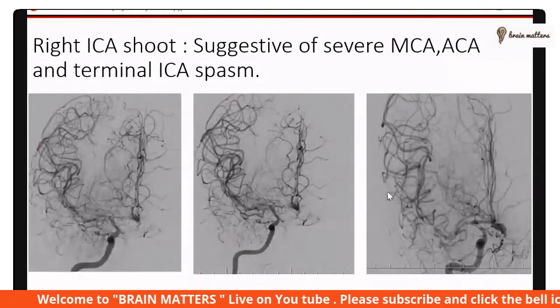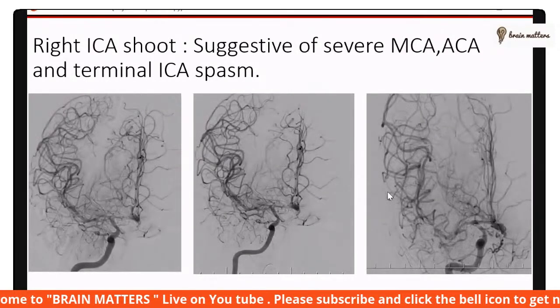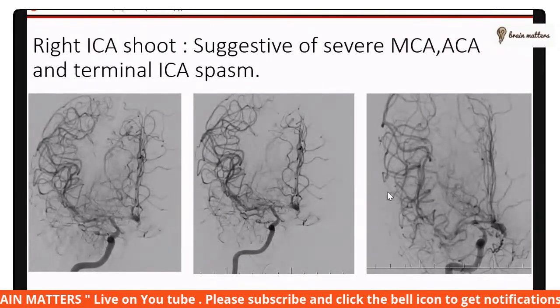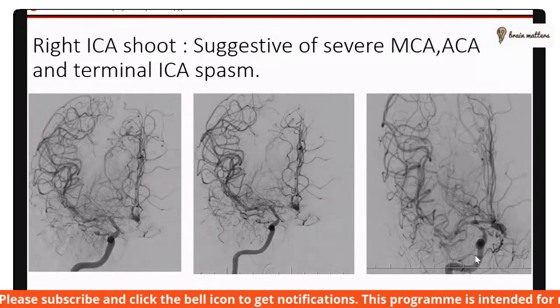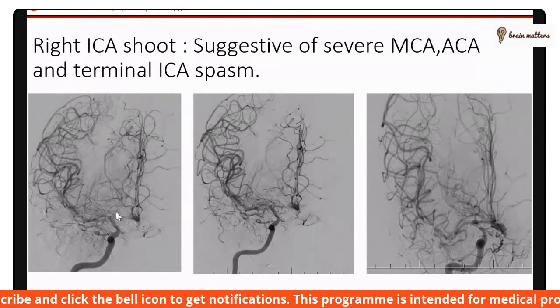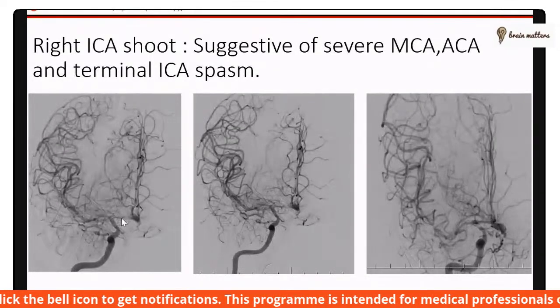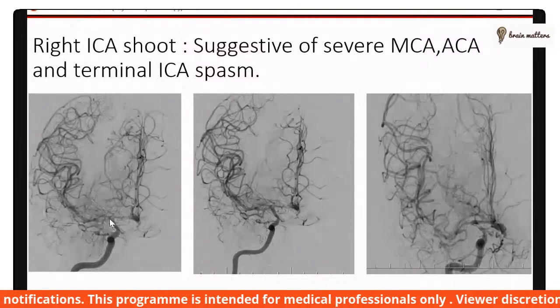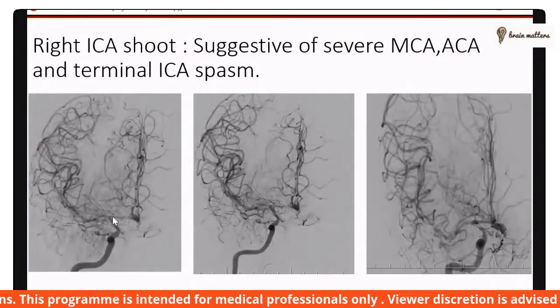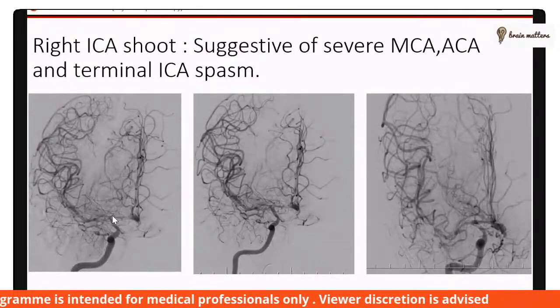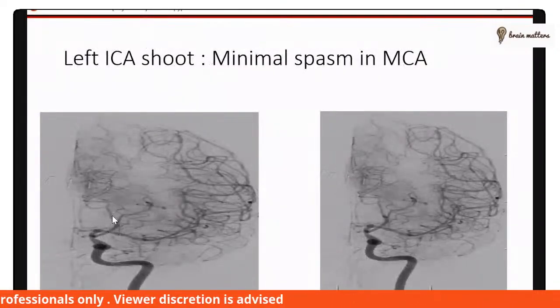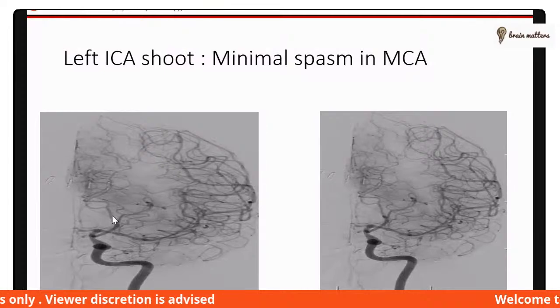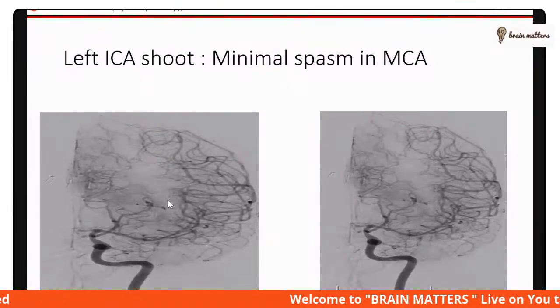DSA was performed. Right ICA angiogram was suggestive of severe spasm in the MCA, ACA, and terminal ICA. Left ICA angiogram showed minimal spasm in the MCA.